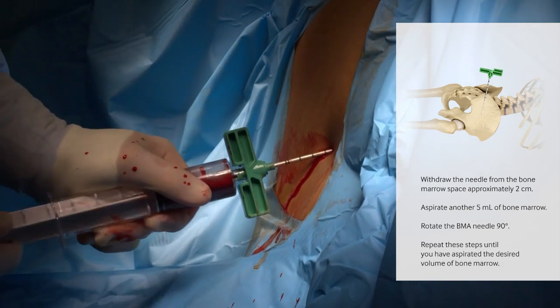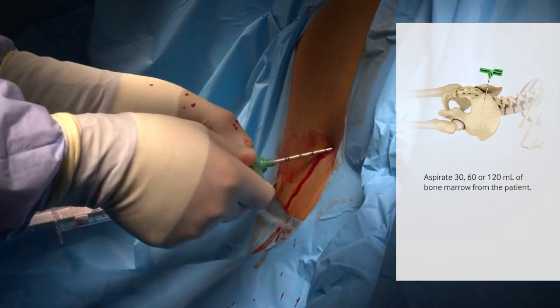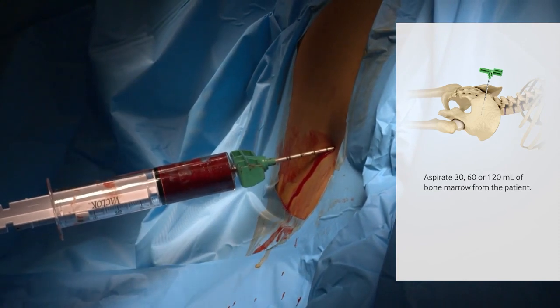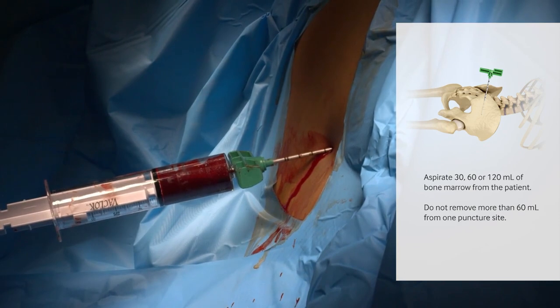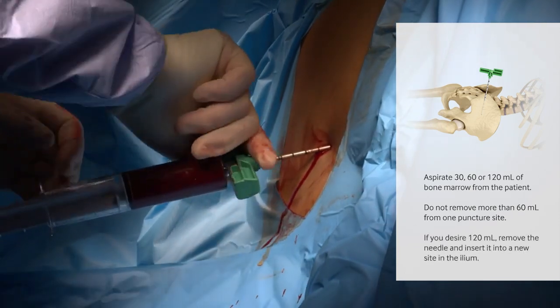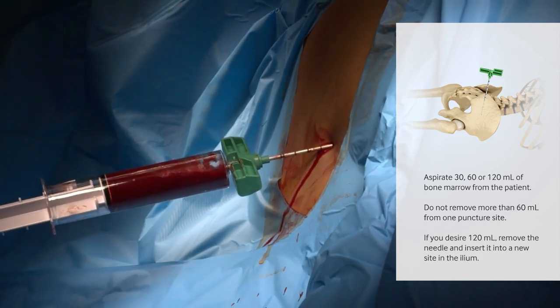Repeat these steps until you have aspirated the desired volume — 30, 60, or 120 milliliters of bone marrow from the patient. Do not remove more than 60 milliliters from one puncture site. If you want 120 milliliters, remove the needle and insert it into a new site in the ilium.